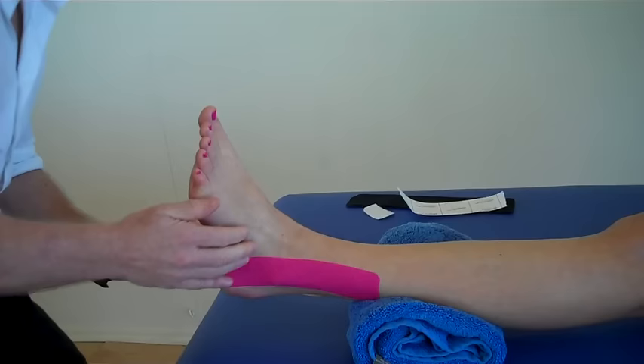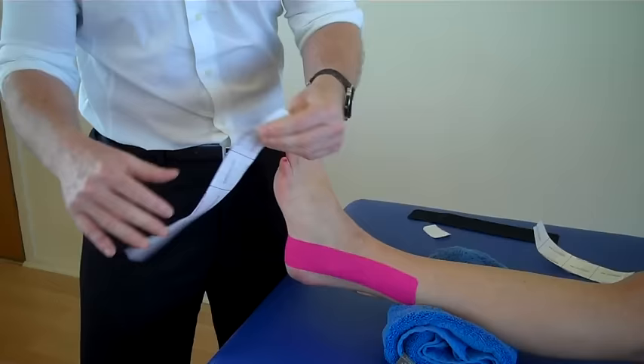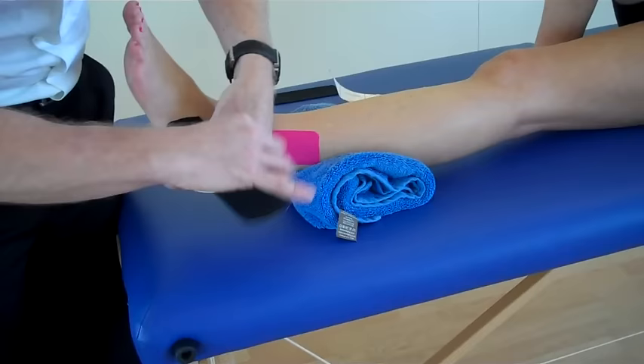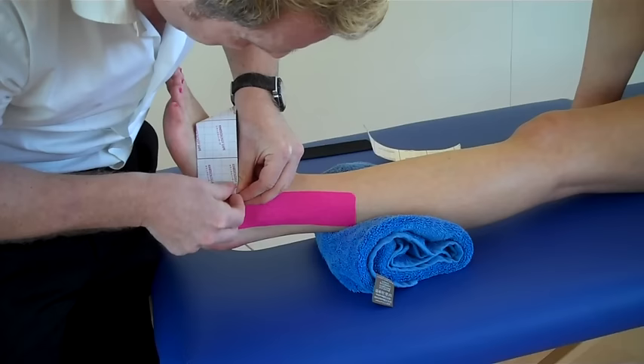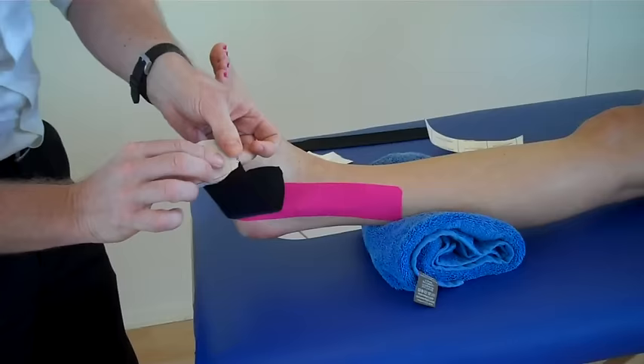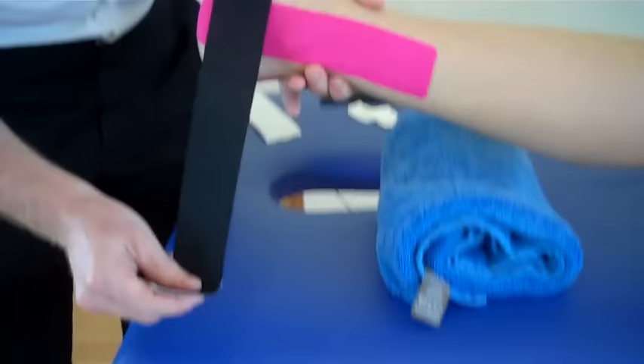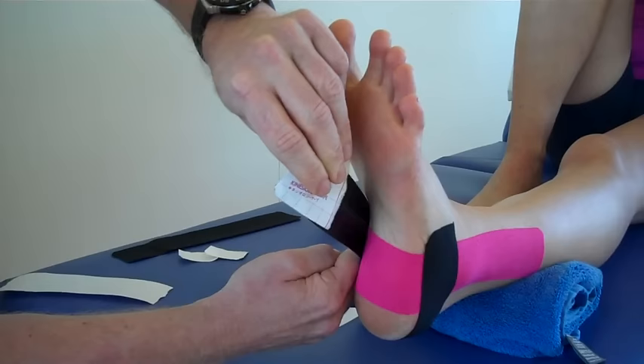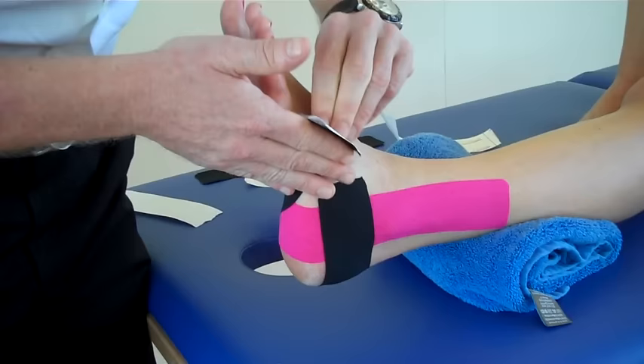The second part, we're going to go from the lateral side using another eye strip. Split the tape and place that around there with no stretch, peel back the tape, and pull it to the end and break that. Now this time we're going to apply — lifting the foot up — 100% stretch, so we're going to go 50%, come around, mould that in, then come around and under the plantar surface, then come on top with no stretch at the end.